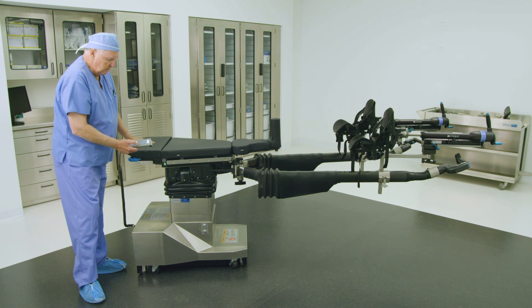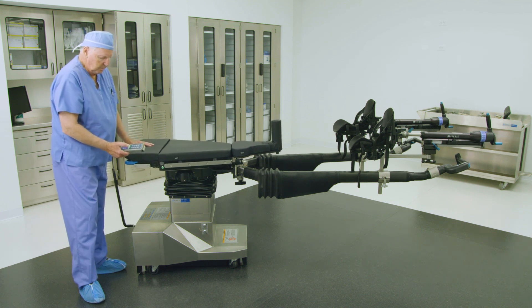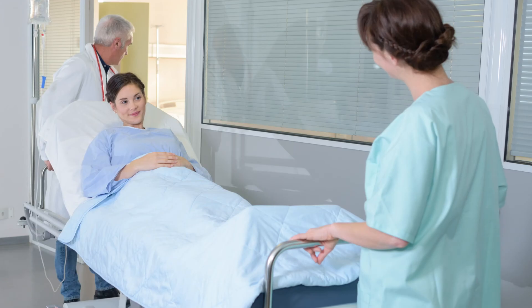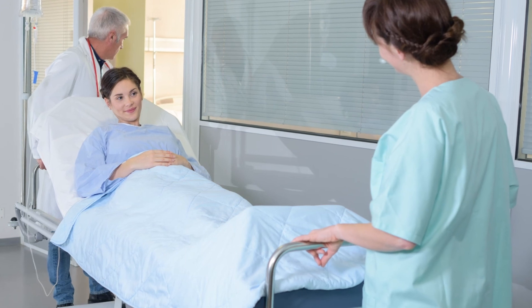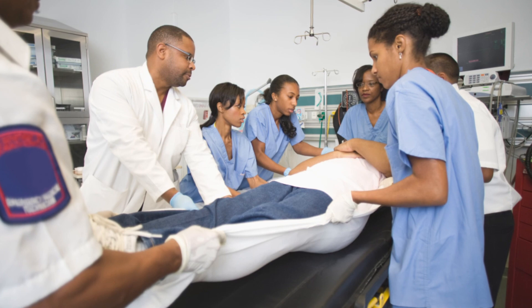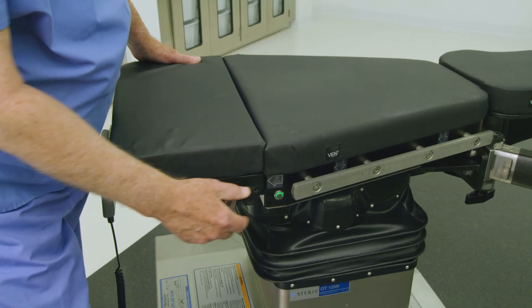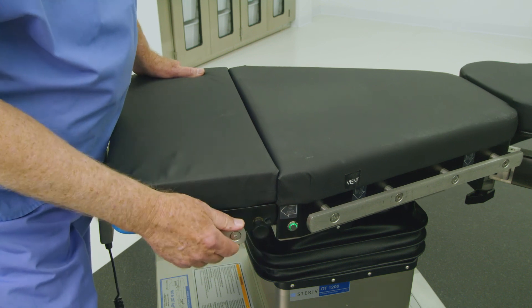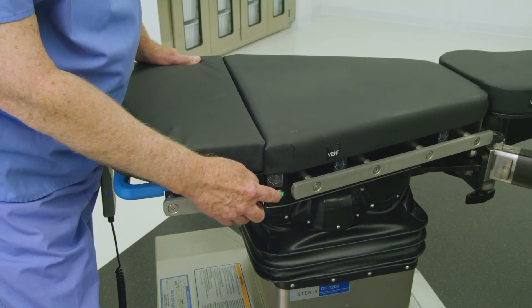The table is now ready for patient transfer. Execute patient transfer using facility protocols for safe patient handling and ensure even patient weight distribution. Once the patient is positioned safely on the tabletop surface, adjust the tabletop by repeating the instructions to obtain the desired lateral tabletop position.